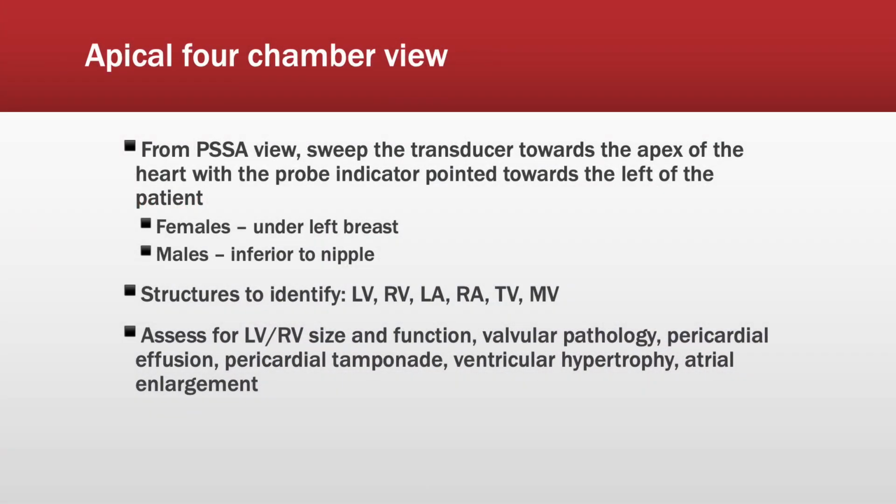The apical four-chamber view is probably one of the most challenging views to obtain as a novice sonographer, but it is also one of the most important views to be able to obtain when doing hemodynamic assessments of the heart, such as diastolic dysfunction, valvular regurgitation, and cardiac output.